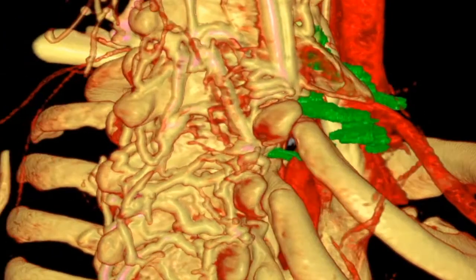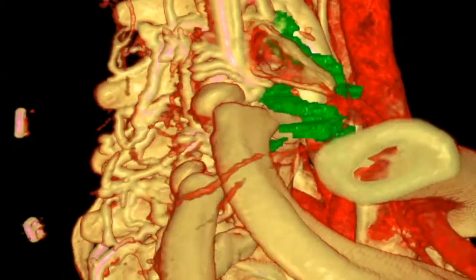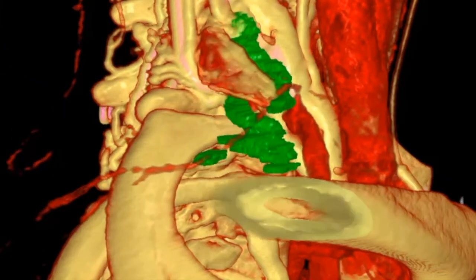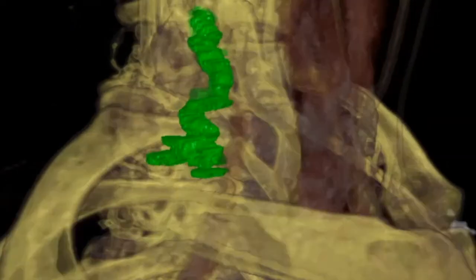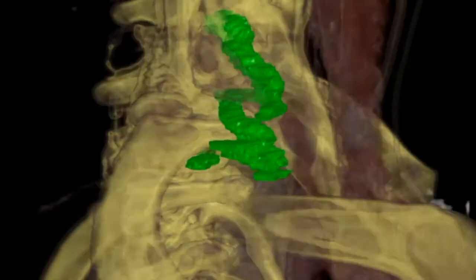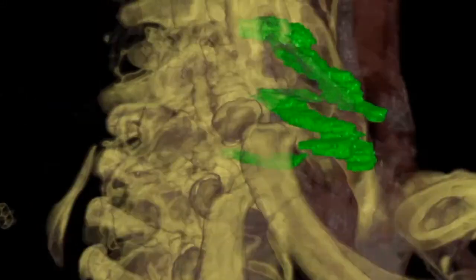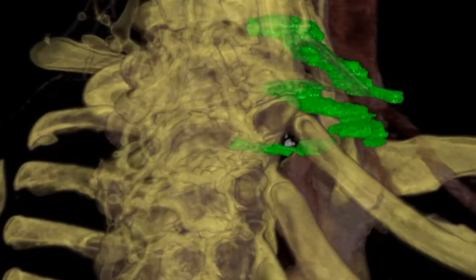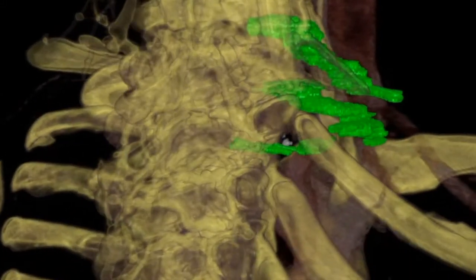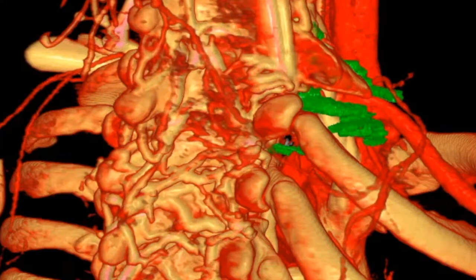The green structures are the nerves of C7, C8, and T1. Here we can see with ghosting of the bones, we can see where the nerves are related to the arteries.